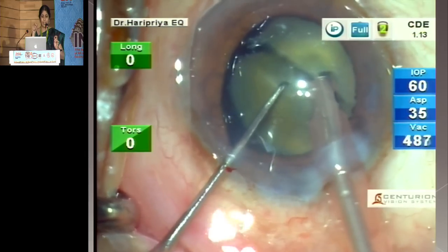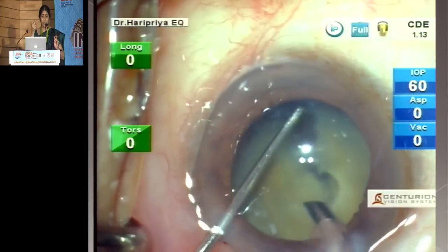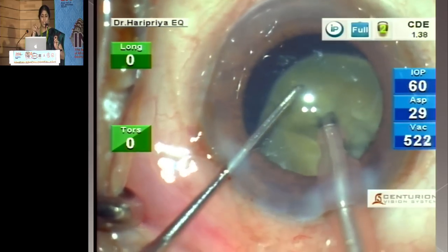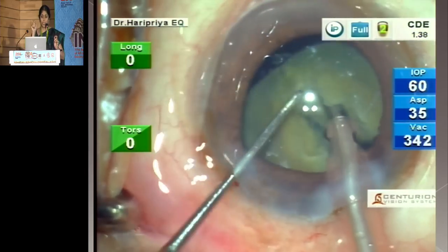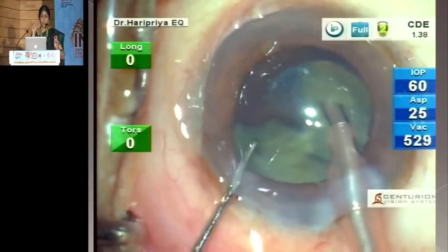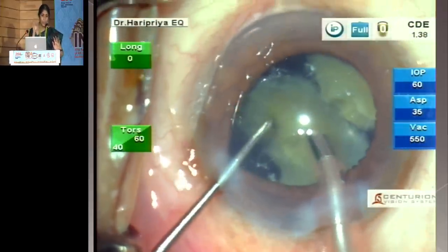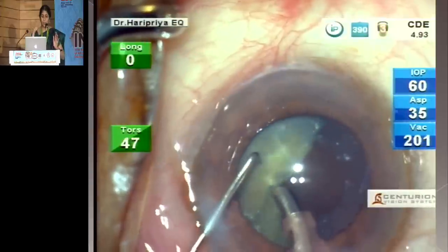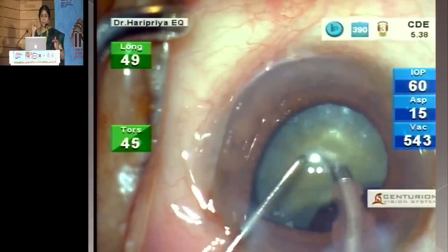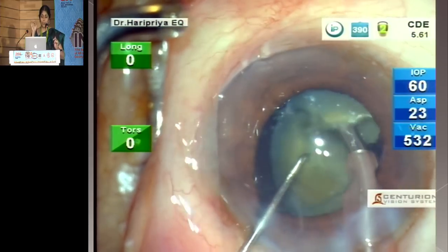kind of a dense cataract, you'll have to have good cutting. That's why retracting the sleeve, so you have more of the tip exposed, will ensure you have a good hold. Hold on the lower half of the nucleus, if possible the lower third, and continue to hold as you chop. Again, you don't have the epinucleus cushion and you have a smaller nucleus, so this tends to revolve in the back, and also you can kind of flip. Having an absolutely stable chamber enables us to ensure the procedure goes under control.